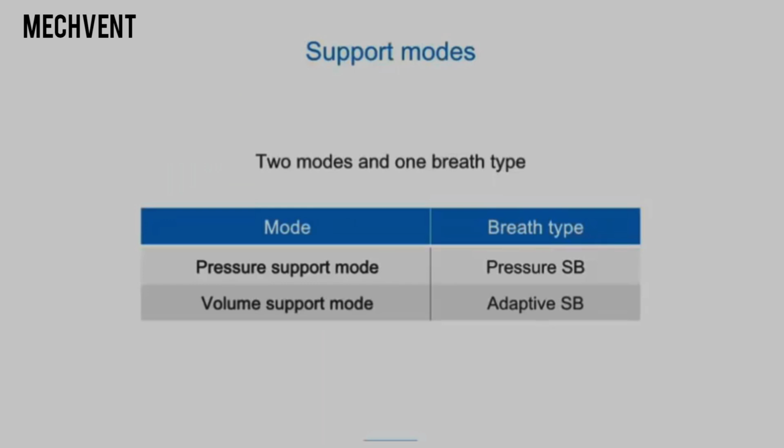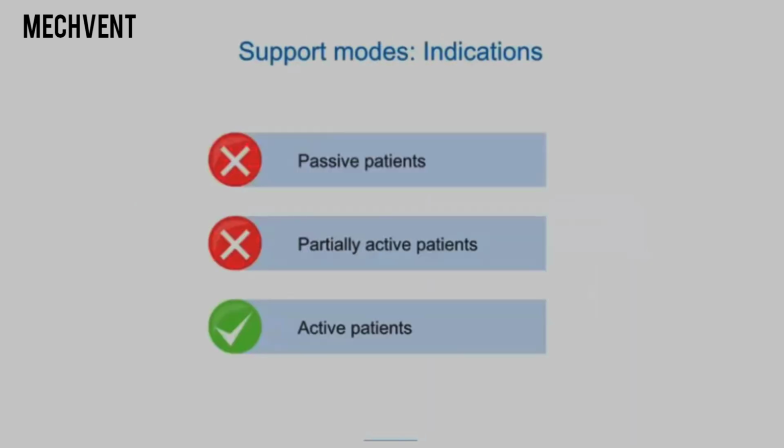Support modes. This group has 2 modes, pressure support mode and volume support mode. Each has just one breath type, pressure SB for pressure support mode, and adaptive SB for volume support mode. In support modes, there is no backup rate.